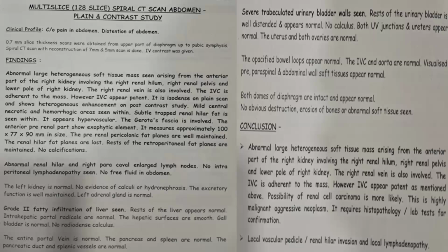Now, in this patient with one large mass which is involving the renal vein, which is adherent to the IVC, in all probability we are heading towards a radical nephrectomy. So here, you should first clear the left kidney, document the left kidney is good, and then plan the right radical nephrectomy.